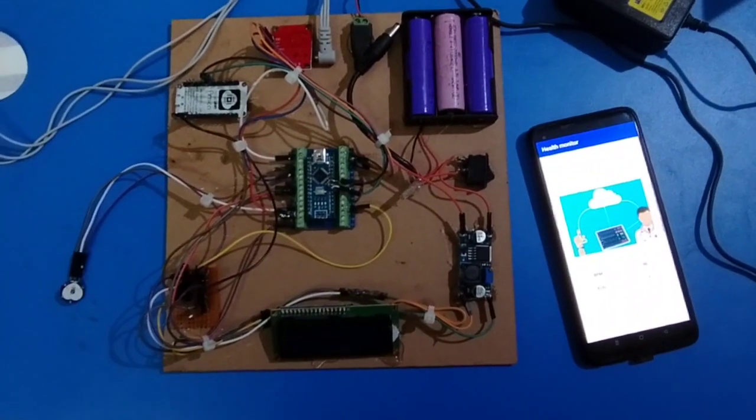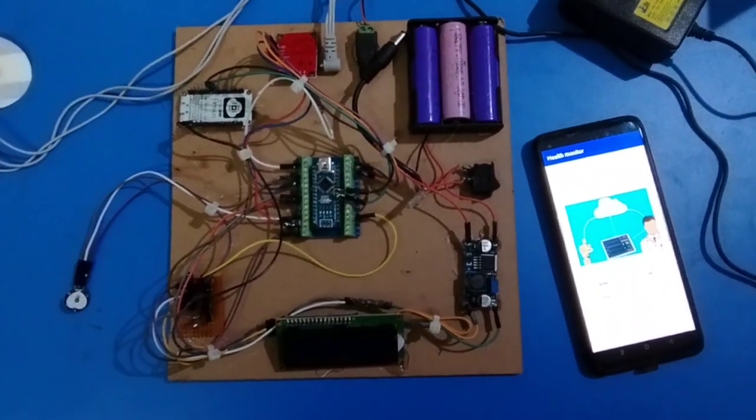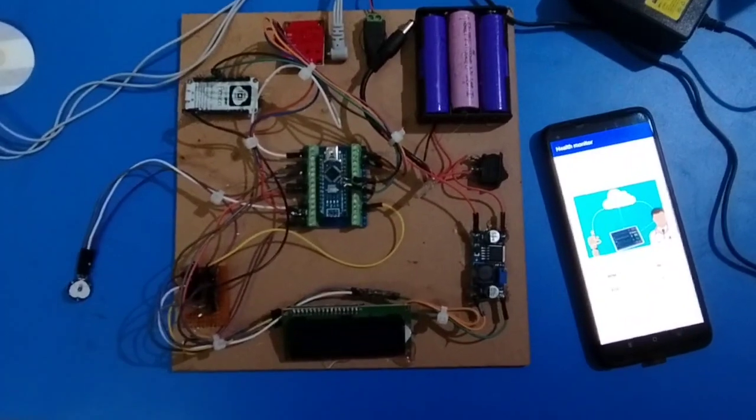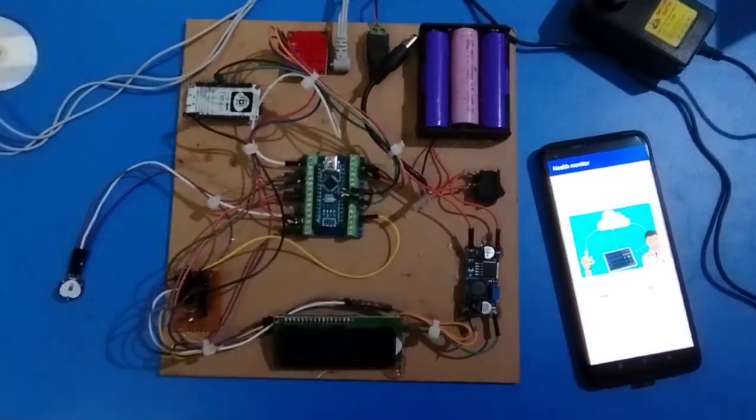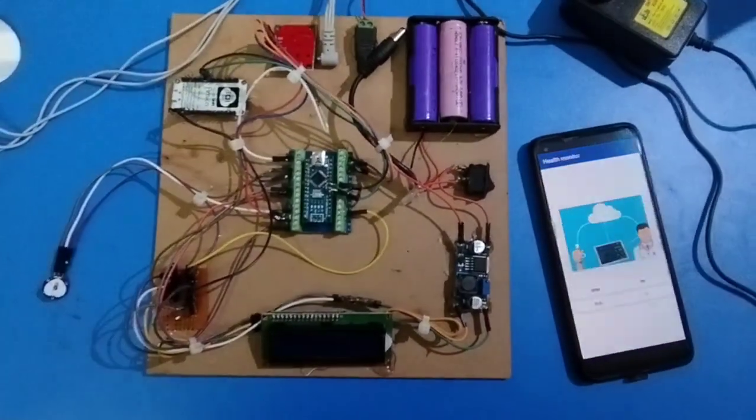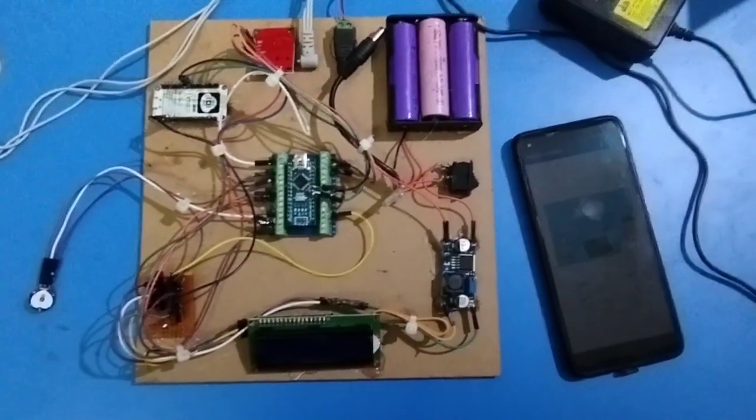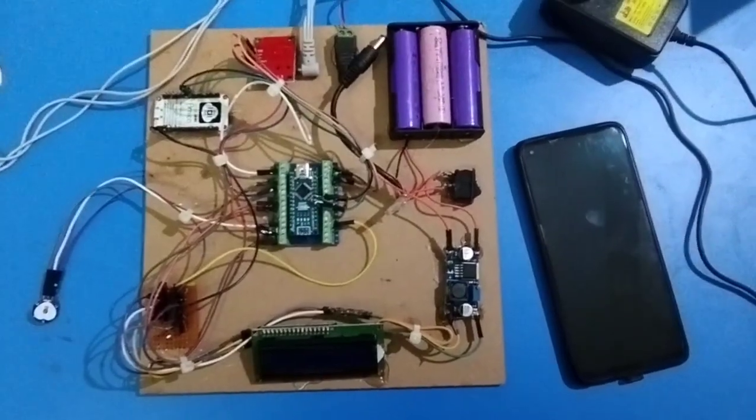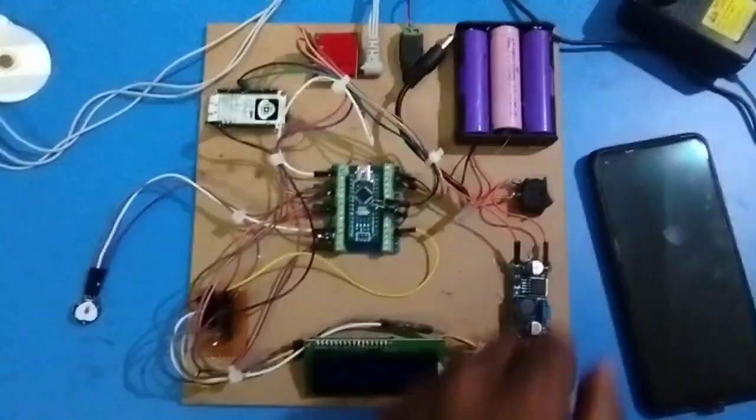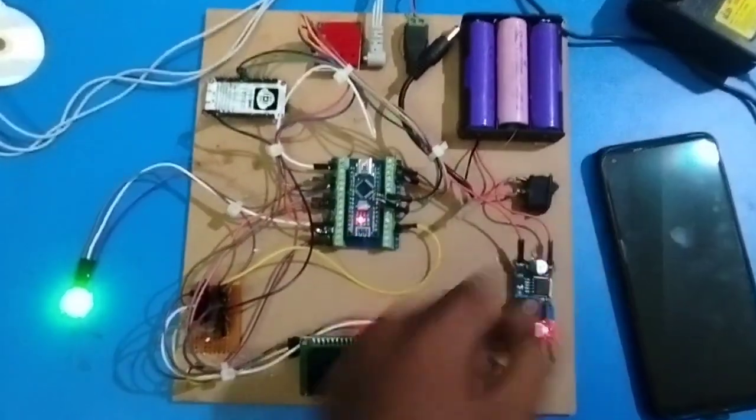Hi friends, welcome to EPIT Research Labs Private Limited. Today we come with a new project which is health monitoring and IoT device. Let's go to the working of the project. We are initially making switches on.